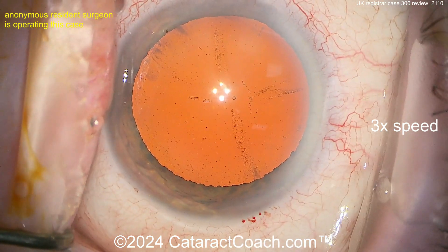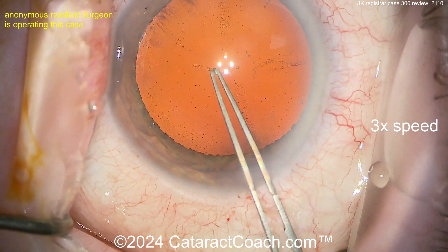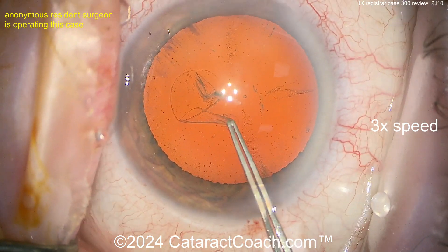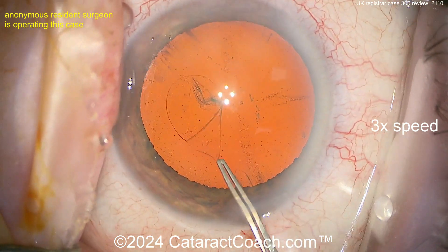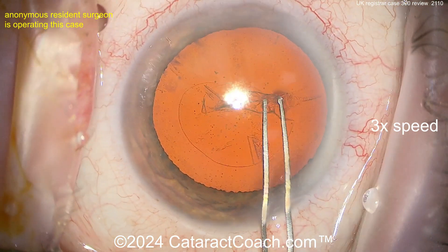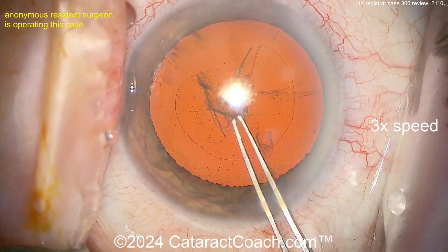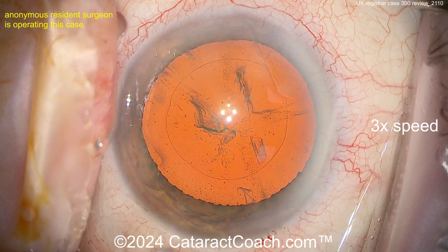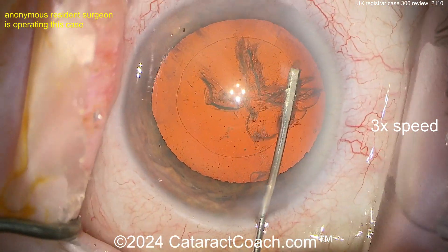Very nicely done. Now poking it with the forceps — that's a good technique for most routine cases. You just don't need a cystotome; you can use the forceps, as I do, as this young doctor is doing. Beautiful pivot technique here — that's a beautiful-looking rhexis for 300 cases. Fantastic!